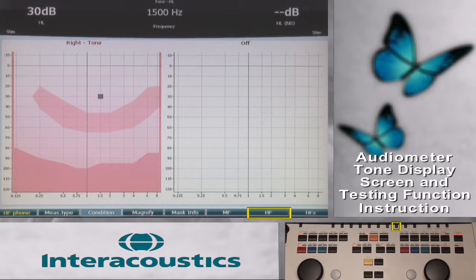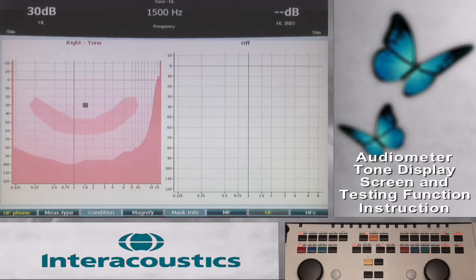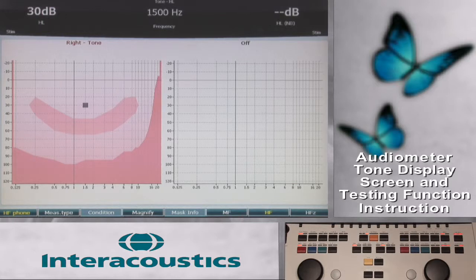The HF, or high frequency, function key displays the audiogram with the addition of 9000 through 20,000 hertz. This key will only become active when the audiometer is licensed for high frequency testing and the HF phone function key is selected first.